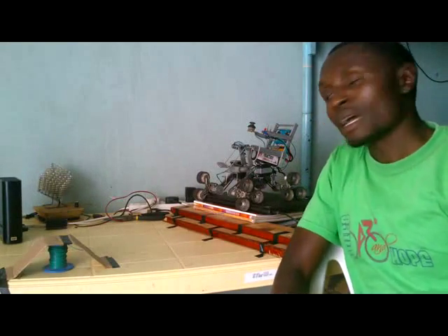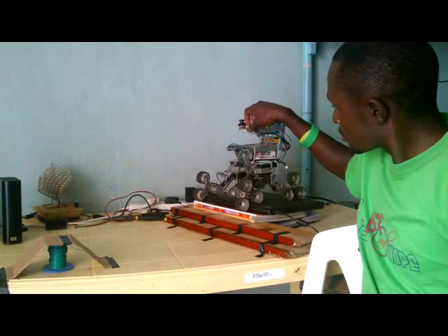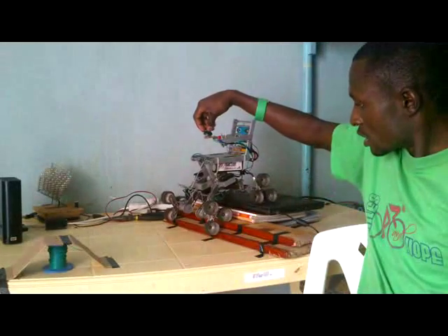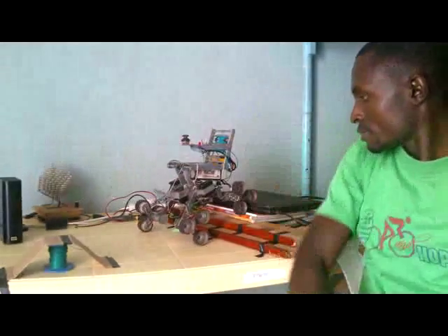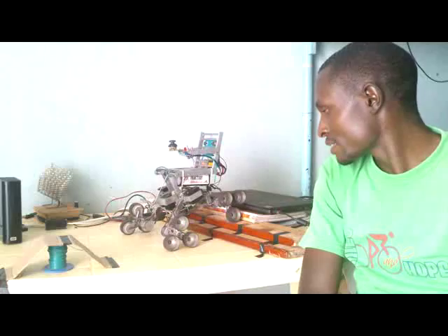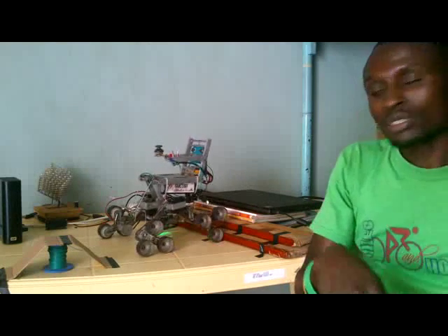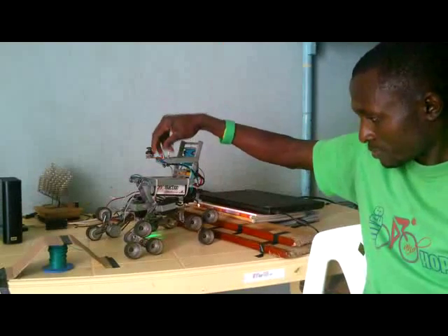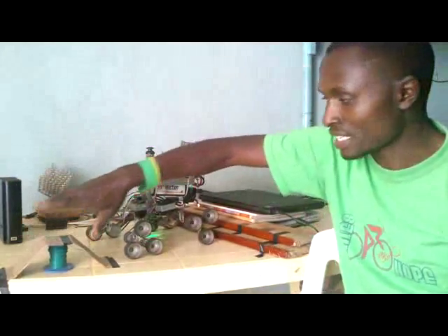There you have it. It has gone upstairs, and now I will enable it to go downstairs. That's an easy task for it. So you will notice that this set of tri wheels are interchanging. Just here for it now to go in the right direction. That's what I was saying, they can interchange. So now it's smooth ground. Now I'll show you while it is moving on uneven terrain. So we have the flat area and we have this area that has a huge bump.